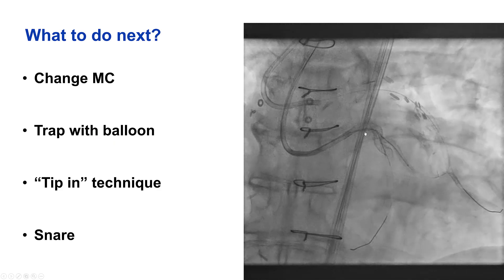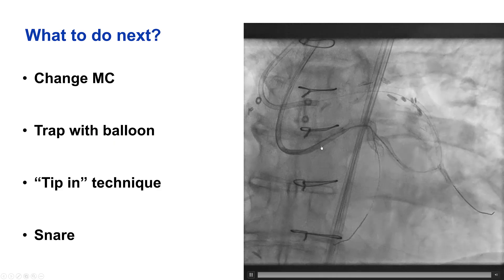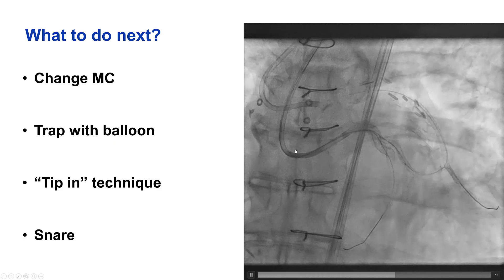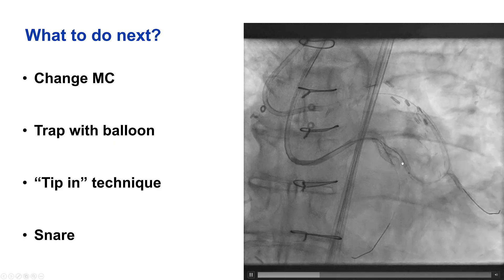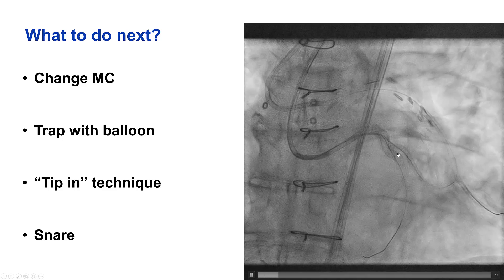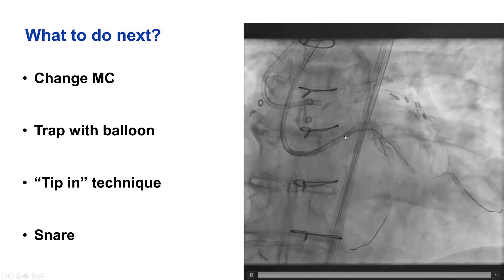We still had retrograde access to the vessel and thought that retrograde crossing might be easier. Sure enough, a polymer jacketed wire was pushed and successfully crossed with a loop back into the antegrade guide catheter. Our initial plan was to advance the retrograde microcatheter, externalize, and then finish with the second kissing balloon inflation. But we had problems again — we just could not get the retrograde microcatheter to go through. We tried also with a Finecross, which is lower profile, but exactly the same problem: it could not go through that area of the bifurcation. We inflated a balloon to trap, but to no avail — the retrograde microcatheter would not cross through.